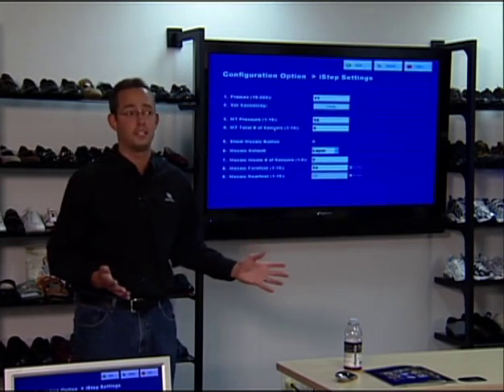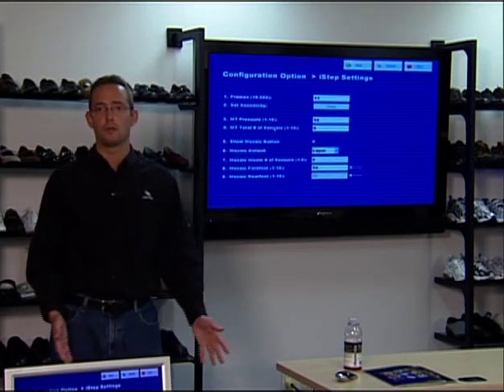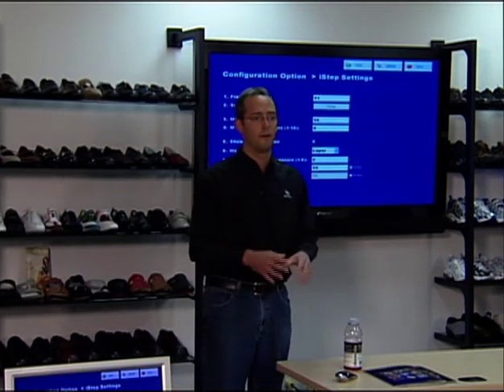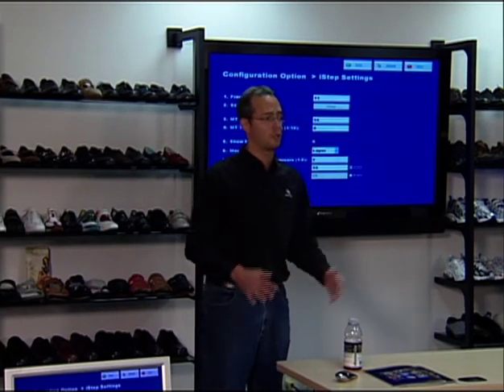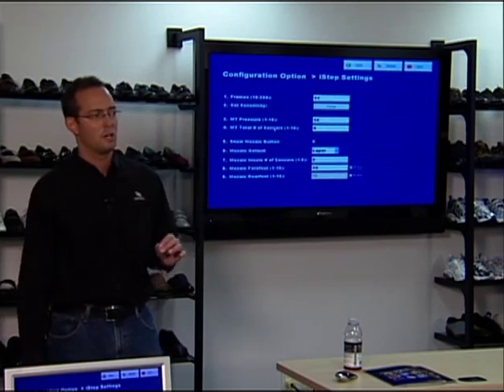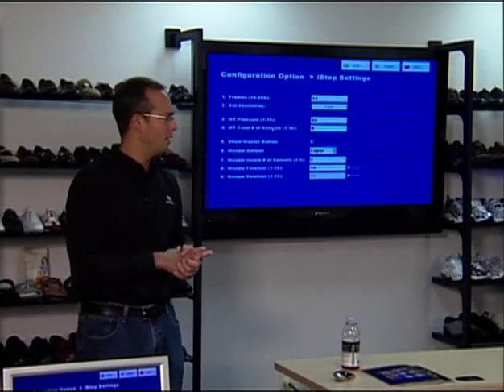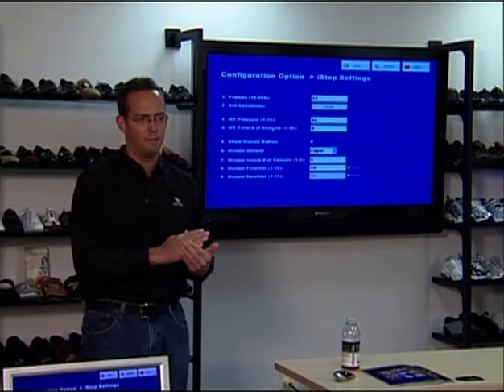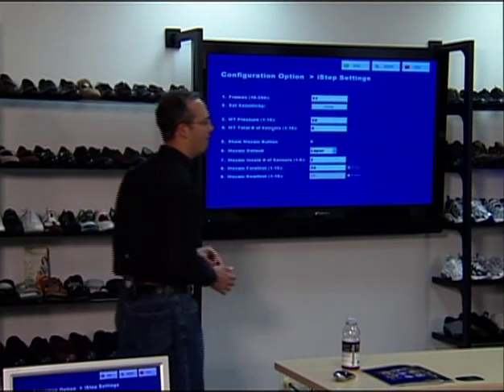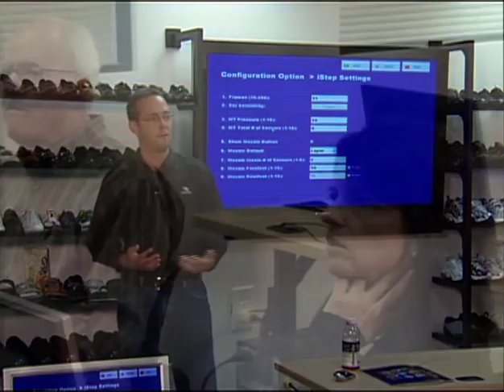200 would be crazy to have everybody stand on the machine for two or three minutes. The machine takes an average of the pressure over those 10 frames. A frame is a little bit less than a second, so a 10-frame test is going to be 7 to 8 seconds. Then it does the infrared section, which is the measurement, and that takes 2 to 3 seconds. So by setting it to 10 or 11, the whole thing is about 10 seconds to get all this great information.